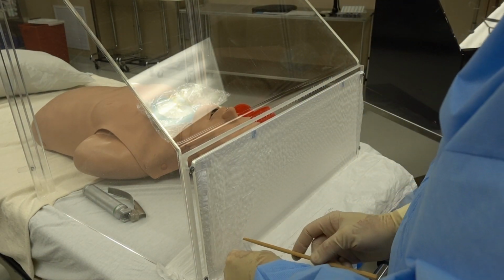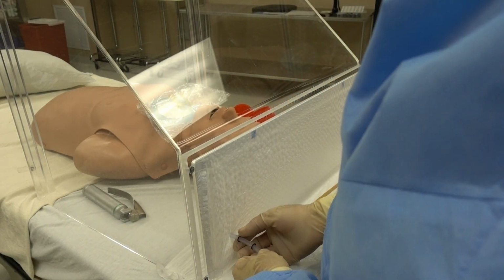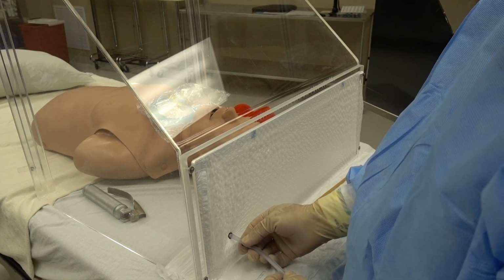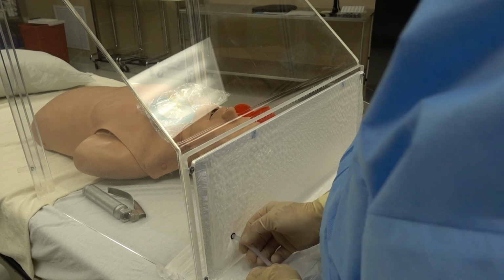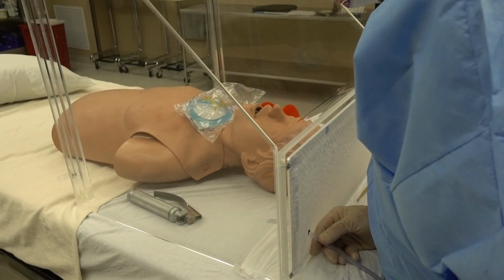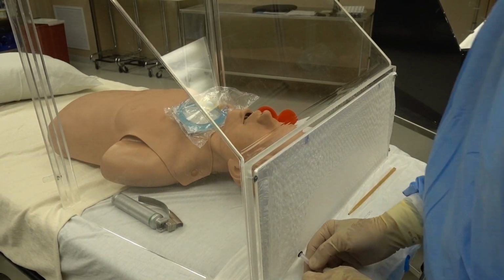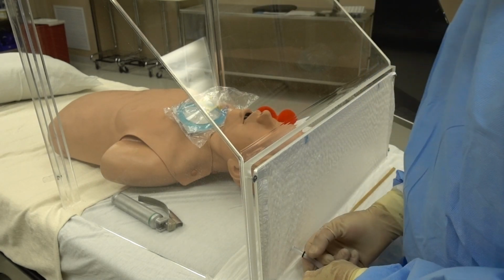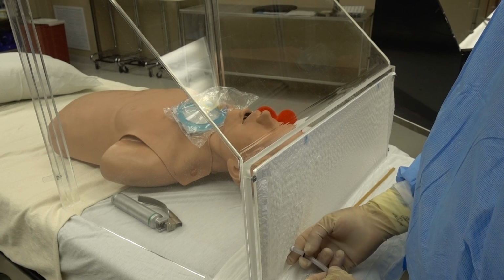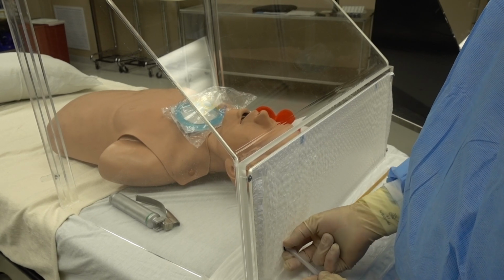So you can pull this out and you gently place this in here and make sure you get it, and that's all there is to it. And you slide it in, it's already sealed. But you want to push this right up and push this O-ring clear through so it goes through both sides. Once it's through both sides, and I don't know if you can see that, I'm going to turn the bed. There it is. You pull it back till you feel it. Then you roll this one up, and you can actually see you can get the inner bag to come out. You just roll this up real quickly, and you've got a seal.